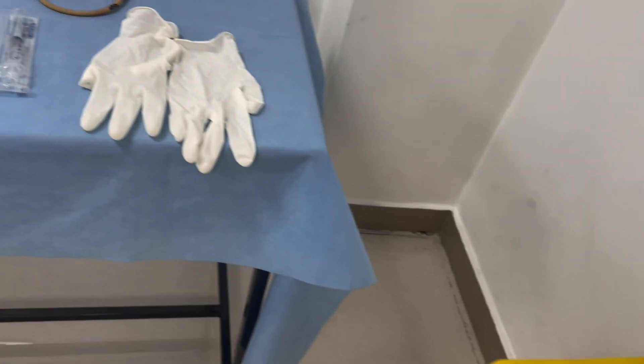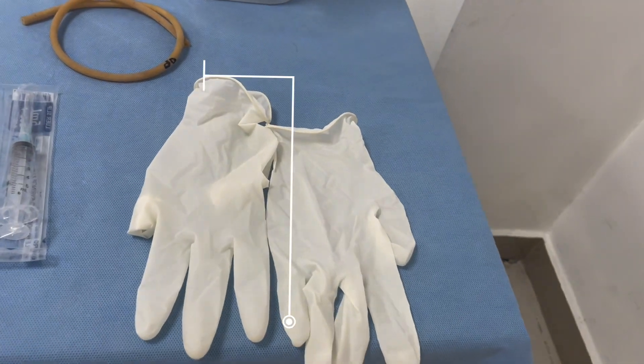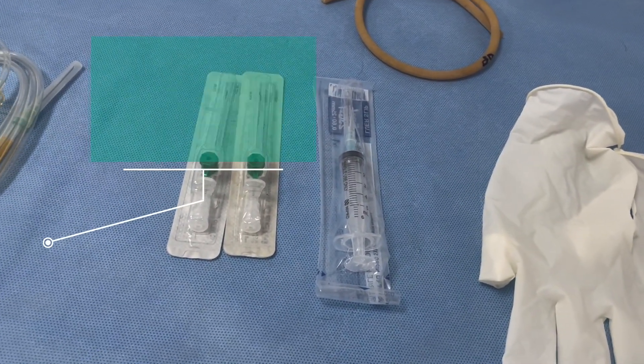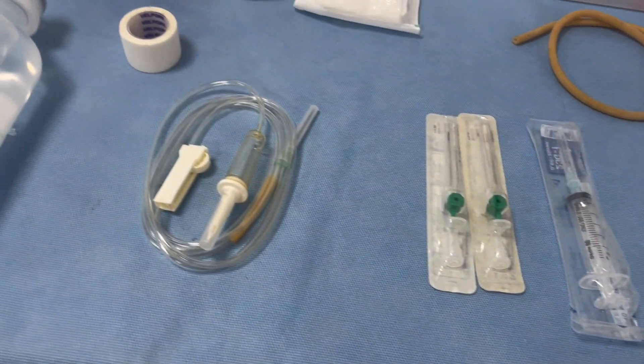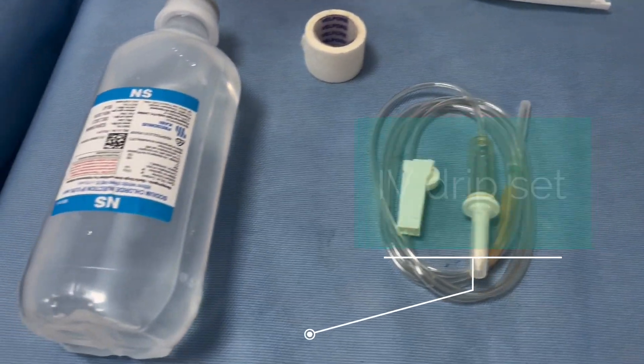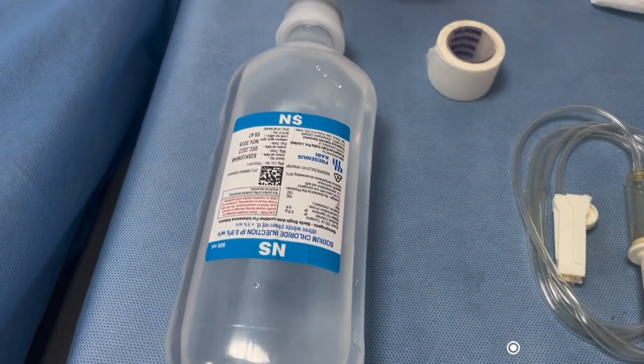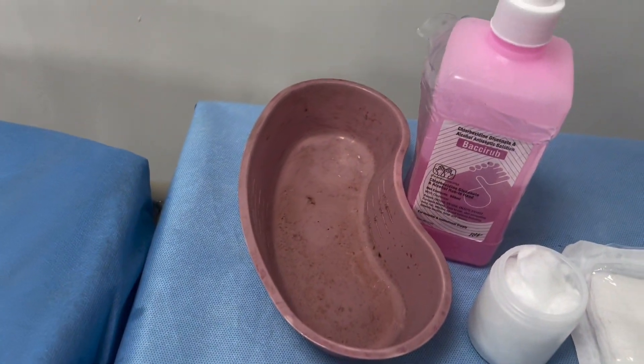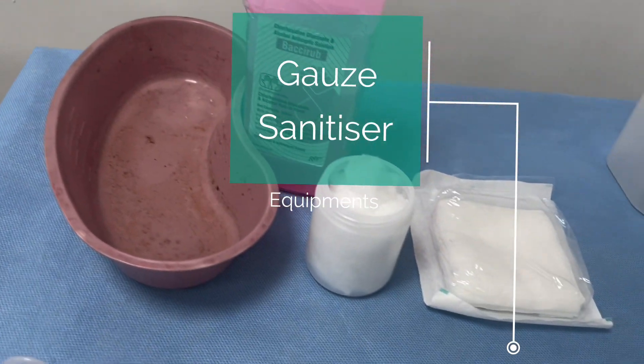The first step is to gather and keep ready all the equipment. The equipment needed for this procedure are gloves, the IV cannula and syringes, the IV drip set, the IV fluid bottle, and plaster for securing the IV cannula.